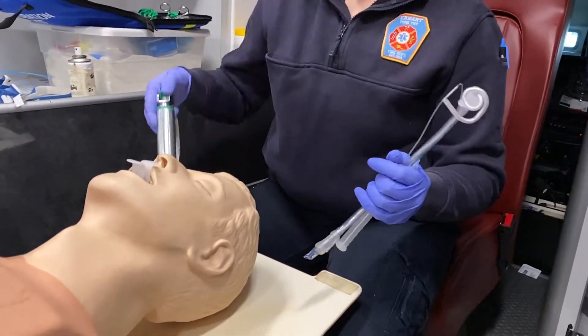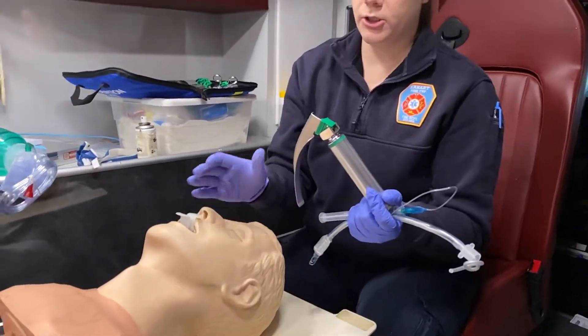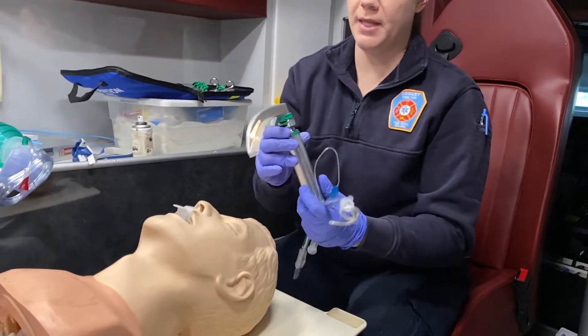You also need to make sure that your laryngoscope is ready. I've chosen a size 4 MAC blade for this patient. You want to make sure it works — that your light is bright and tight, especially if you have a removable bulb at the end.